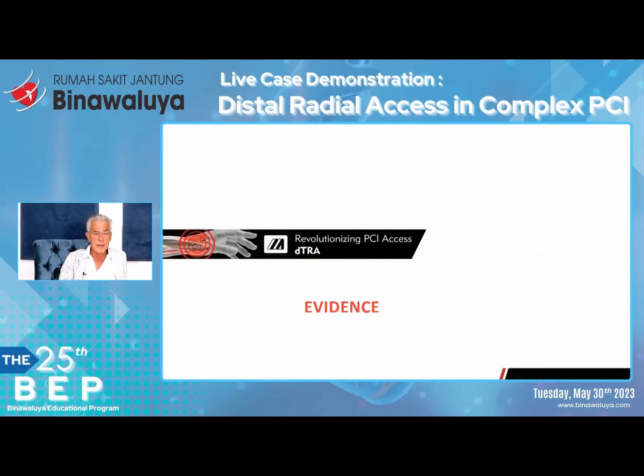But of course, you can enter the radial artery from both left and right side. So my personal preference is to use the non-dominant hand, so the snuffbox of the non-dominant hand, so that the patient has the dominant hand free and the non-dominant hand is used for access. So how about evidence?